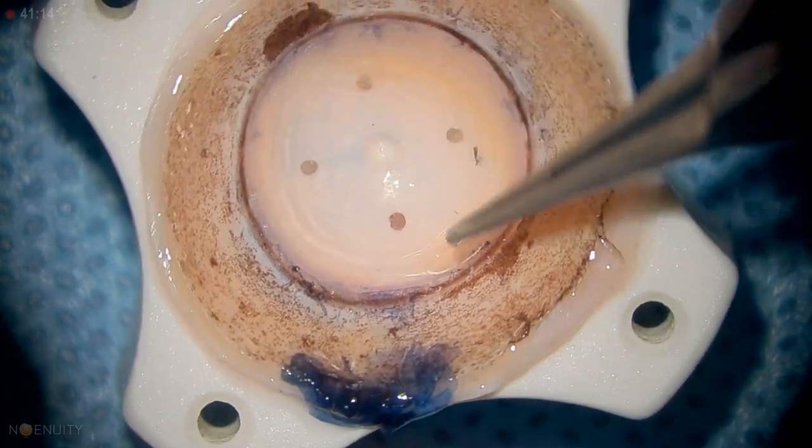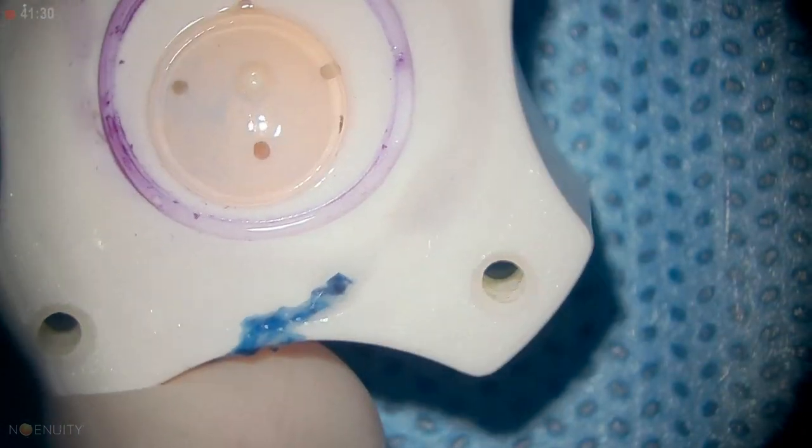You want to see a little bit of purple all the way around — it looks good. We got the same size: 7.5. Spin it, make sure it's okay, and then lift. And then we've got a corneo-scleral button there.